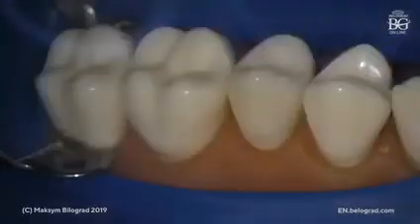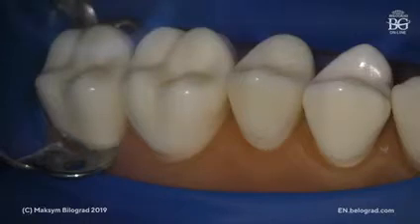In this masterclass we will skip the mock up. We will just prep teeth through their own structures here, and I will show you in very precise detail all steps of these preparations for all these three teeth.